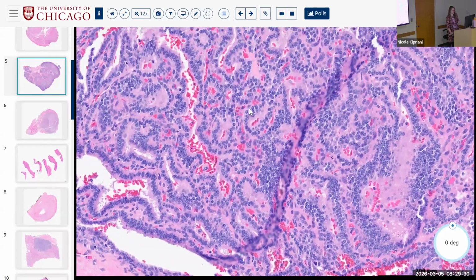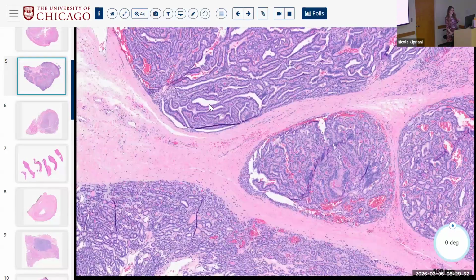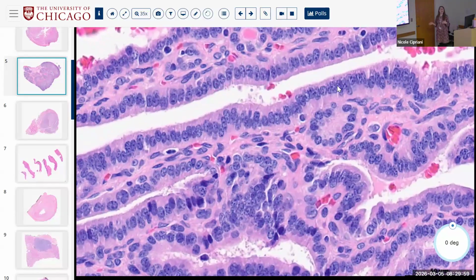What about the nuclei? They look more follicular. Yeah, they're super round, super dark, speckledy chromatin, not elongated, not grooved, not wrinkled, right? So this is a very nice example of something that may have papillary architecture and may have tall or columnar appearing cells, with these very long strands, but the nuclei don't match, right?